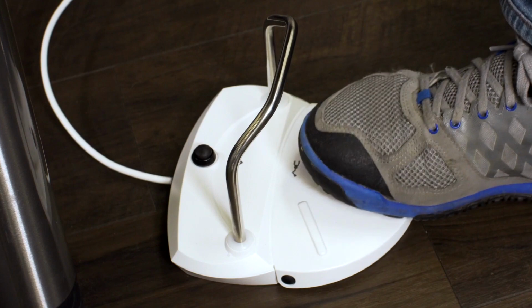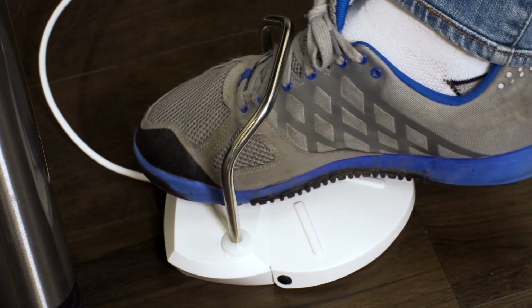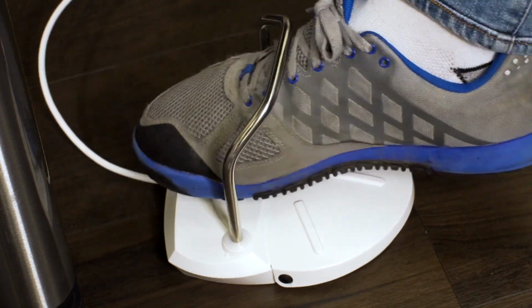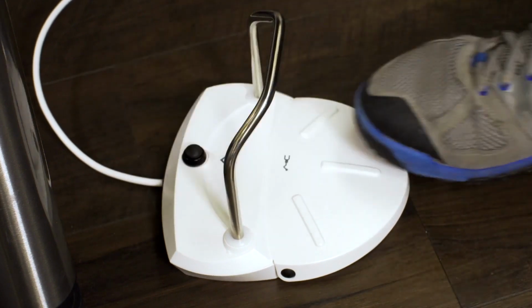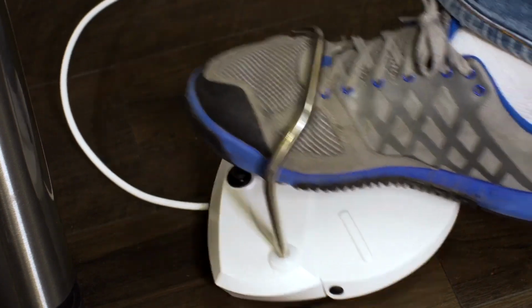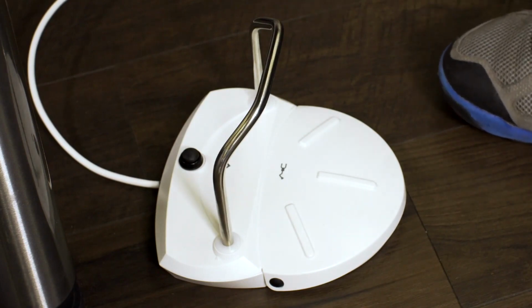It has one button for activating the handpiece. It has a second button in the back that toggles through the bone density. As I push this back button, it goes from D1 to D2 to D3 to D4, so I can control the power output through the back button. I can activate the handpiece through the main pedal, and then I can move it around the surgery room with just my foot, so I don't have to take my gloves off and move it.